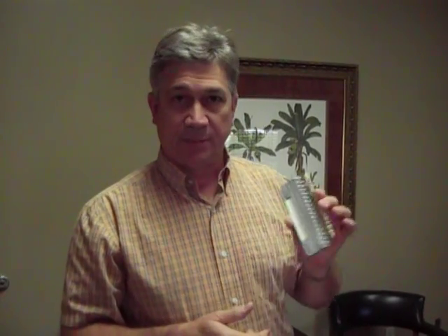Because looking at one color at a time is much easier than picking up a B3 and saying, does that match? Or picking up an A3 and trying to put it up there against the tooth and say, does that match? So one color at a time, locating it, is much easier than putting up something that's got 2 or 3 colors in it at a time.